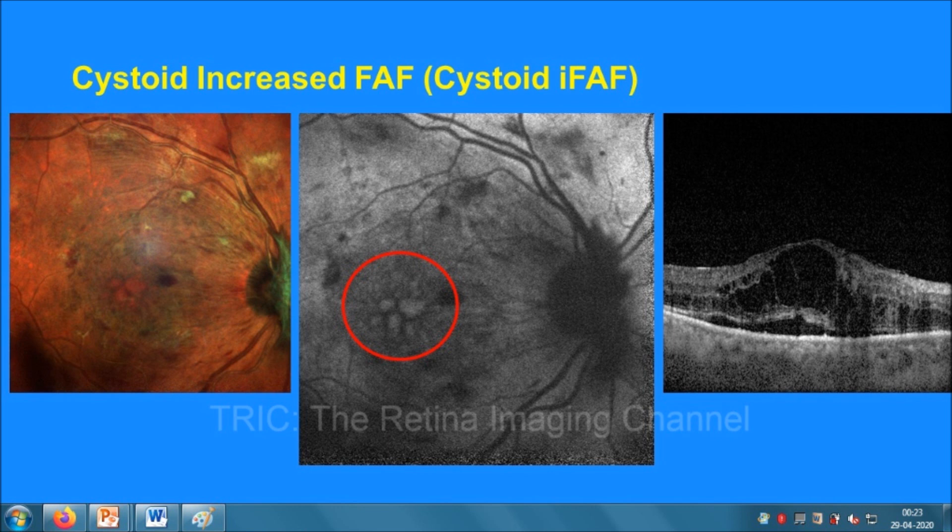Now we'll see some images. We see an orange-red hue at the fovea in the multicolor image on the left side, which is due to CME, and the same can be seen on OCT on the right side. Looking at the autofluorescence pattern at the fovea, there is a petaloid pattern of hyperautofluorescence at the fovea, which is called cystoid increased autofluorescence. The cystoid pattern corresponds to the cysts on OCT.